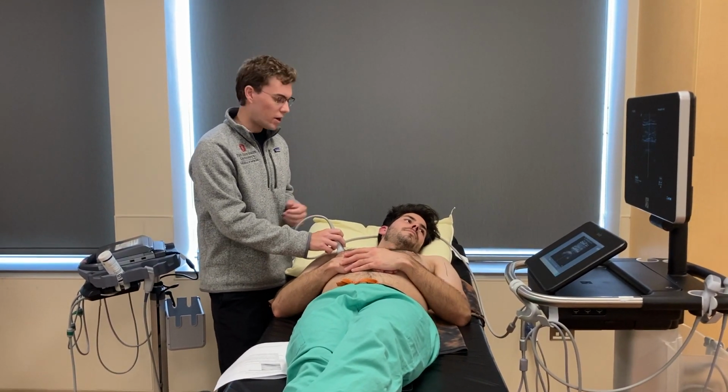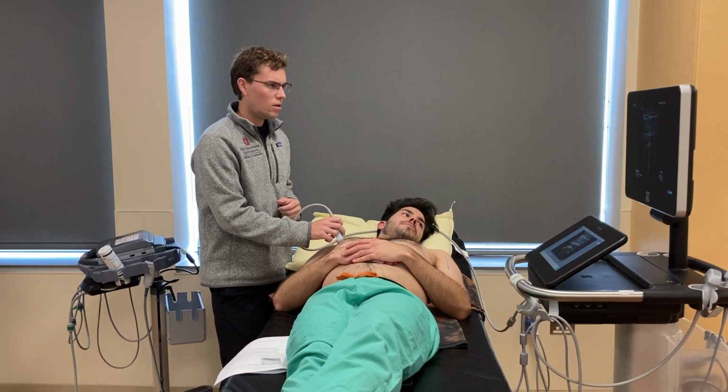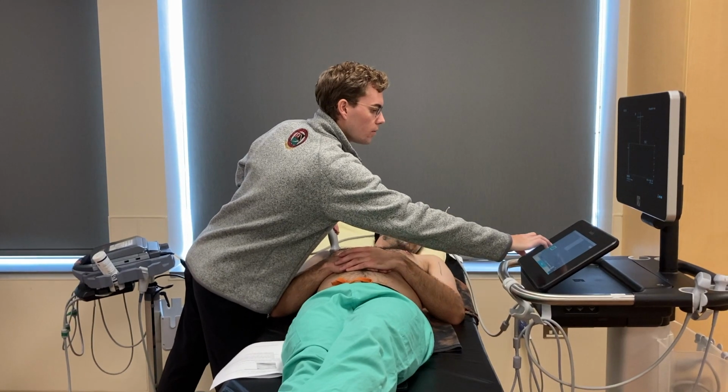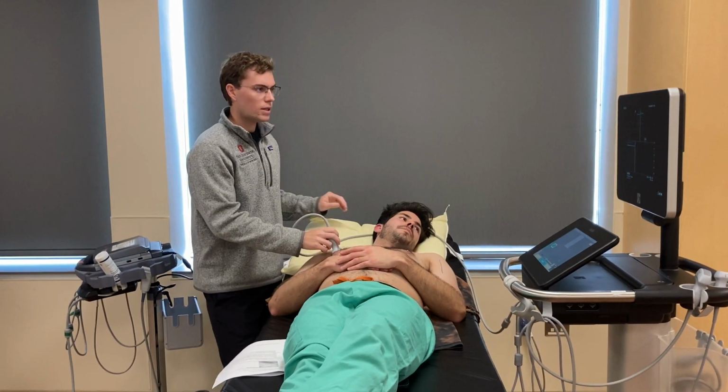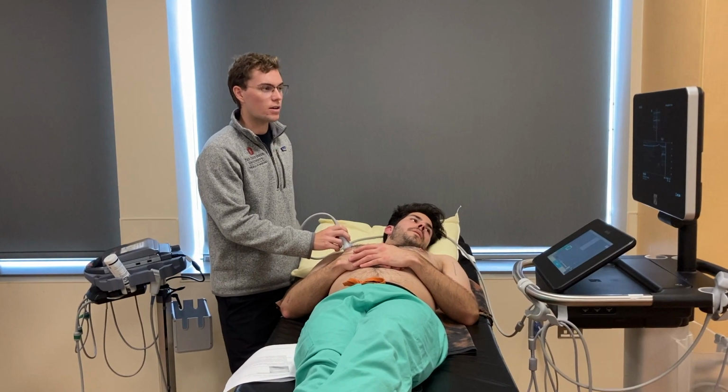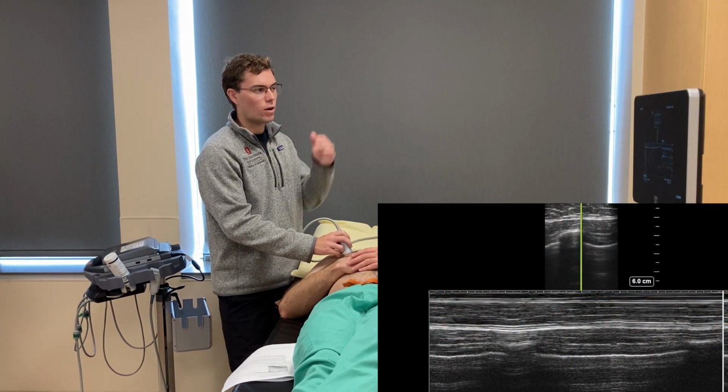Have your proctor breathe, so take a deep breath. Deep breath. And what you're going to see normally is what's called the beach sign. So your M mode is going to look like a beach, water, and then the sand.